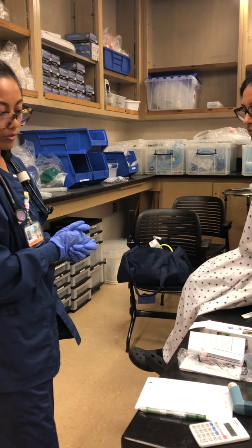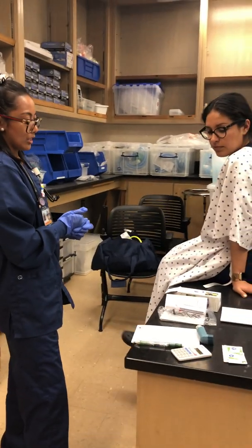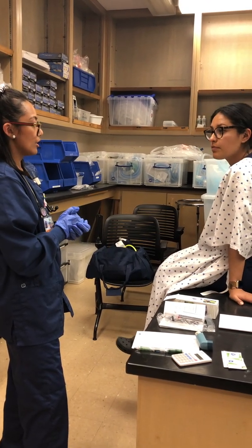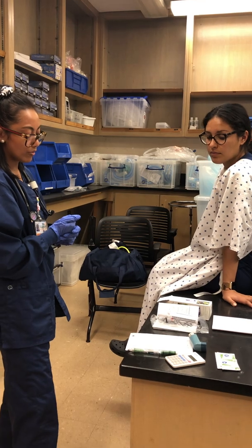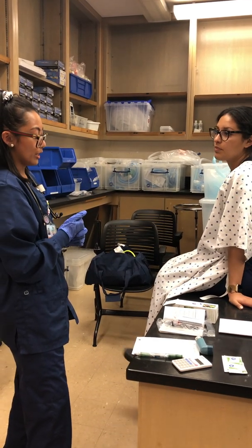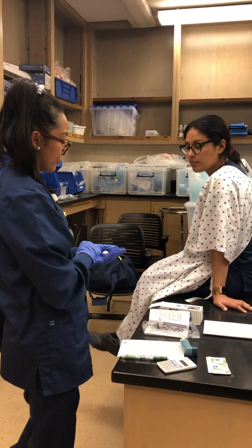Also about albuterol, some side effects that you may get from it are increased heart rate, some tremors, and also some dry mouth. Is that okay? Mhm. Yeah, okay. And then if for any reason the side effects get too much for you, just let us know. But I will monitor you upon administering this, okay?